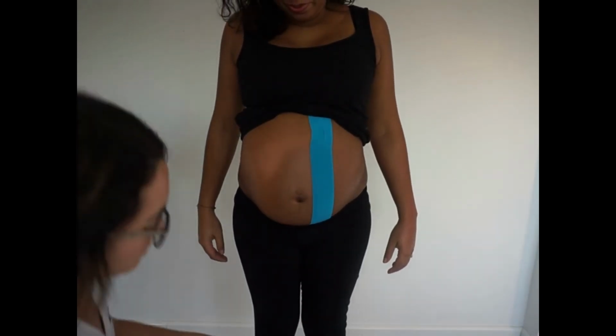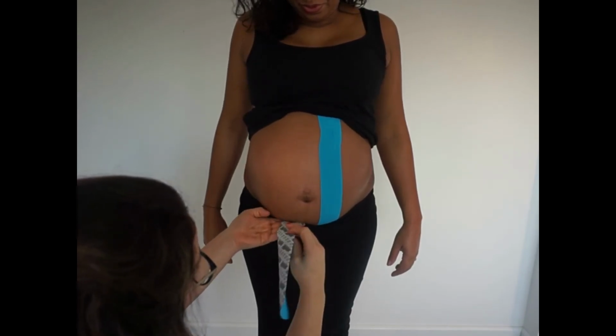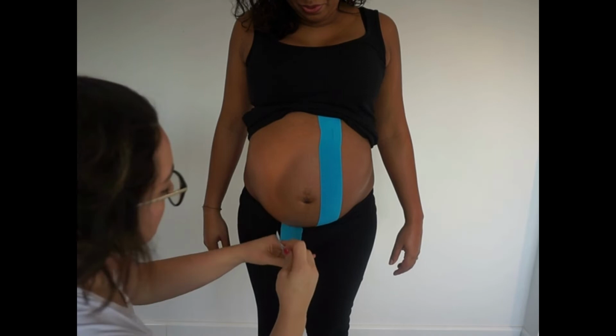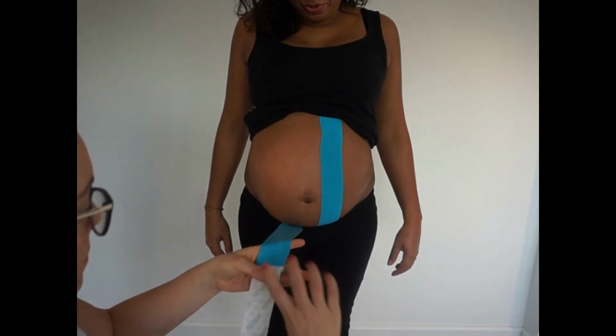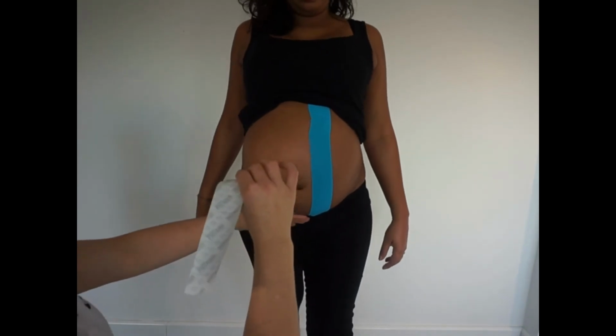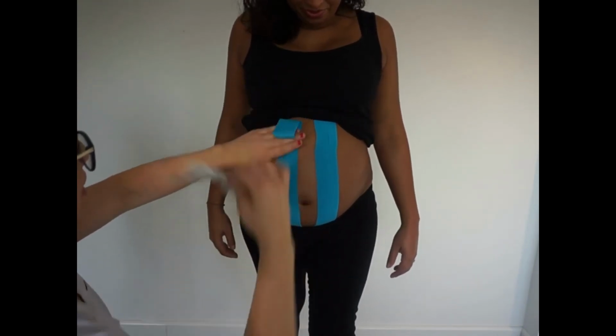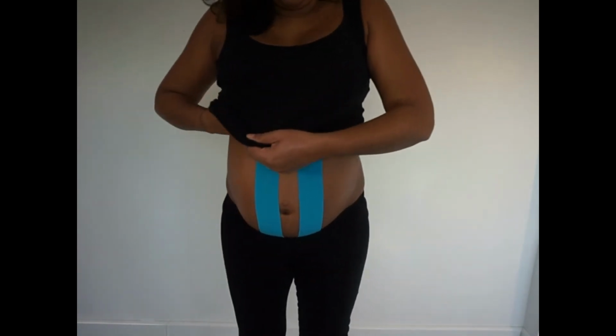So again, we're going to anchor at the origin, so towards the pubis. We're then going to peel back the tape, add a light amount of stretch to the tape, bring our client into hip extension, so a little stretch, and rub the tape well down to stick, anchoring with no tension and no stretch.